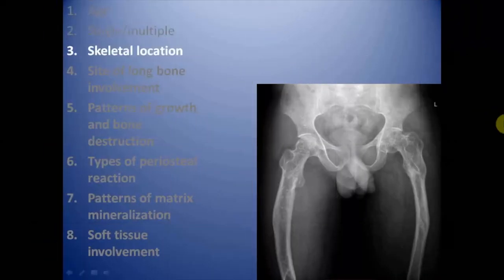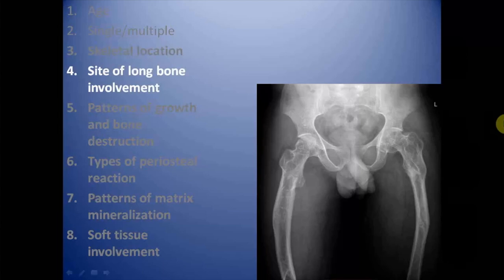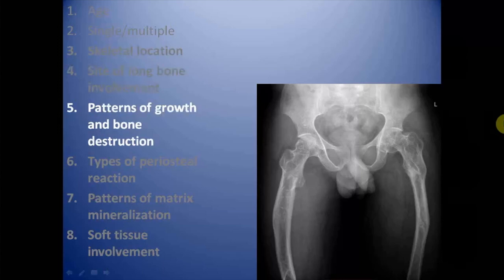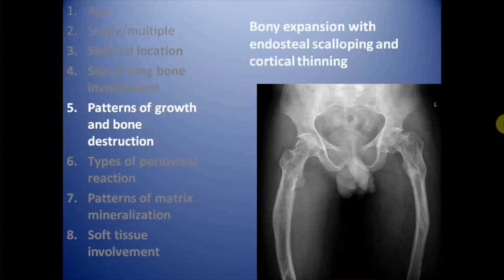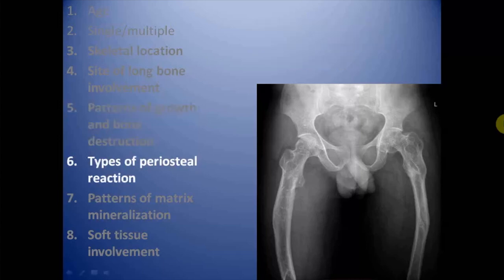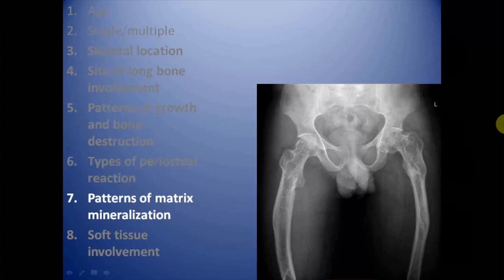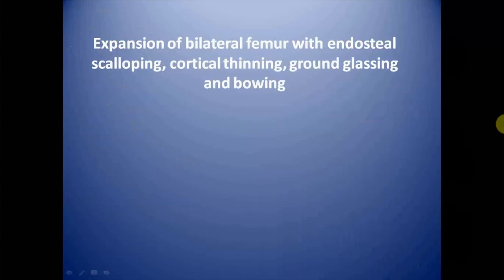The lesions are multiple. Skeletal location is the appendicular skeleton involving long bones. The site of long bone involvement is predominantly diaphyseal but also involving the metaphysis. Pattern of growth and bone destruction: these lesions are causing bone expansion with endosteal scalloping and cortical thinning of a non-aggressive type. There is no obvious matrix mineralization and no soft tissue involvement.